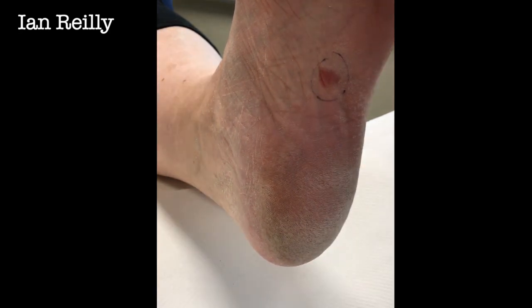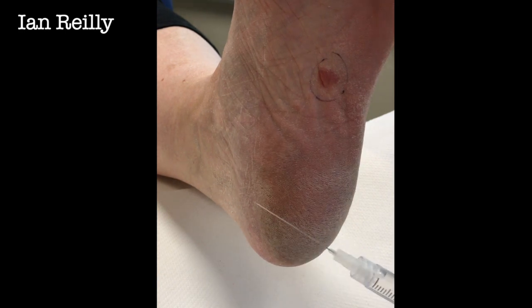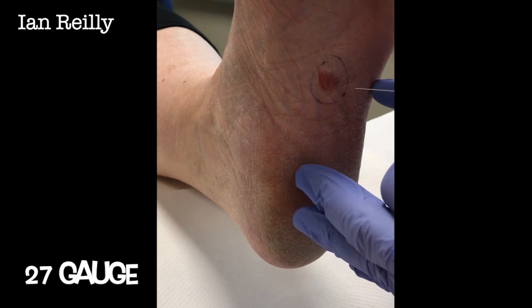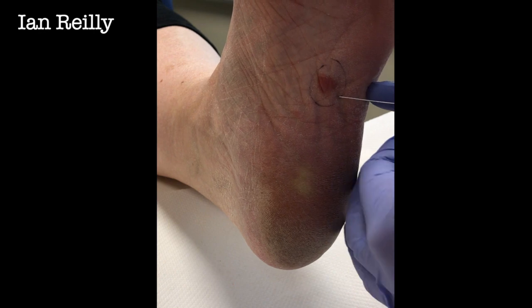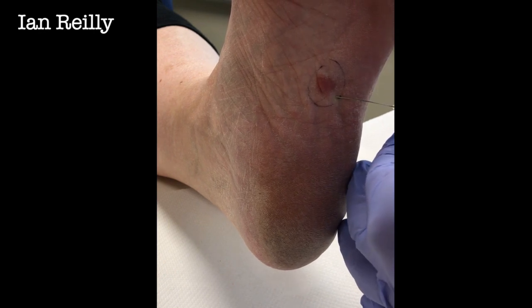of local anaesthesia. One I like to use is a nice 27 gauge needle, nice little whippy blade. So there's going to be a little scratch. 3, 2, 1. That wasn't too bad, was it? That's all right. Okay. And then just a little sting as that goes in.